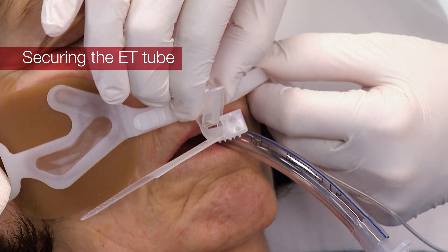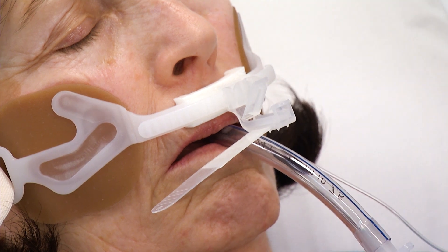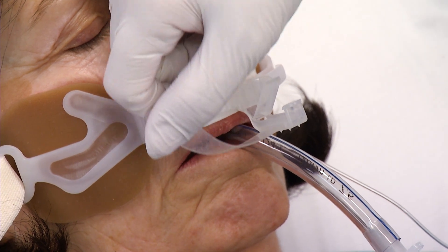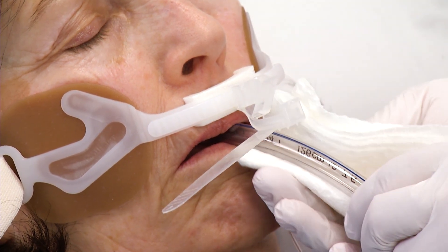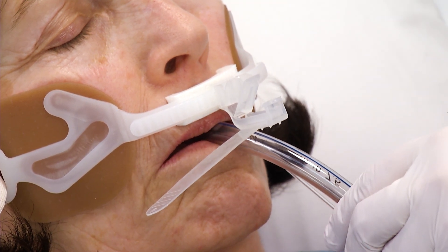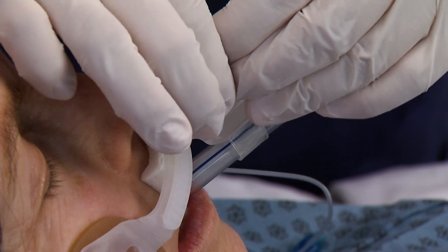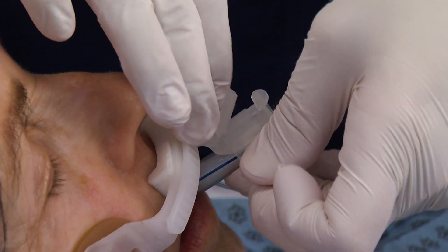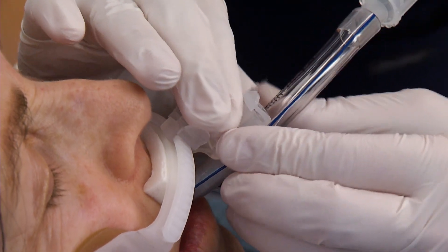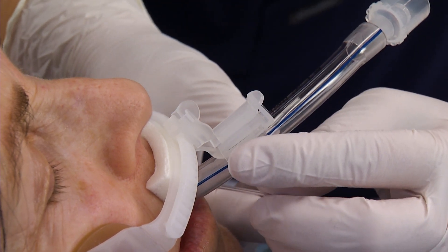Press the two skin barrier pads on the sides of the gliding tube shuttle and move the clamp along the track to a location adjacent to the ET tube. Remove the release liner from the ET tube wrap, exposing the adhesive. Before applying the wrap to the ET tube, make sure the ET tube is dry and free of any residue. Position the ET tube under the non-slip grippers. Loop the wrap tightly around the ET tube. Avoid including any other tubes within the wrap. Pull the remaining portion of the wrap through the security clamp. Secure the wrap by snapping shut the one-click security clamp. An audible click will be heard.